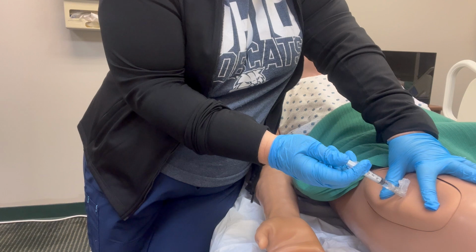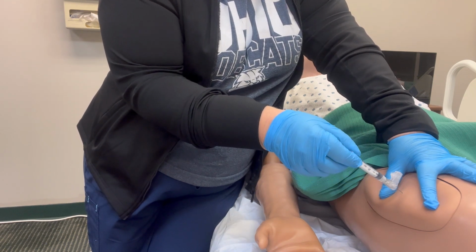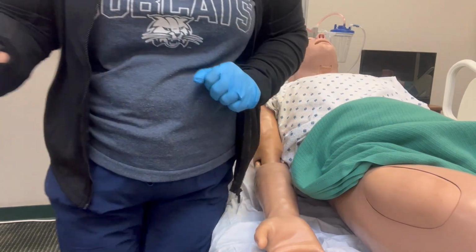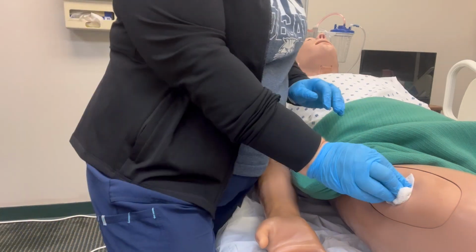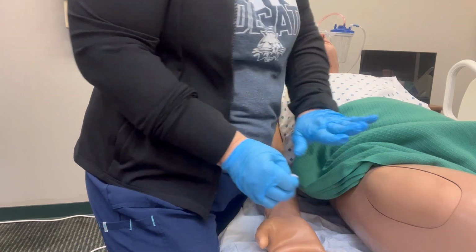We do not aspirate. You do need to pay attention to your facility policy about whether they require you to aspirate or not. And then I'm going to deploy the safety, and then I'm just going to go ahead and apply a little pressure. There might be just a little bit of blood, and then I can apply a Band-Aid.